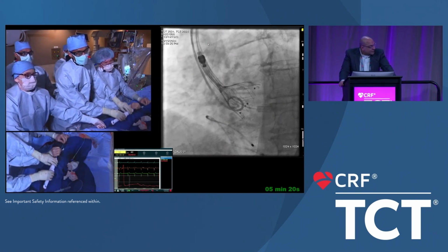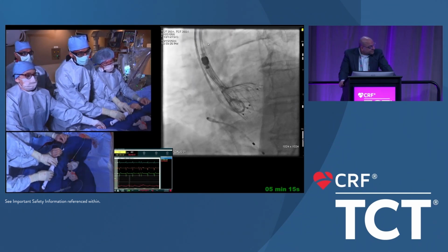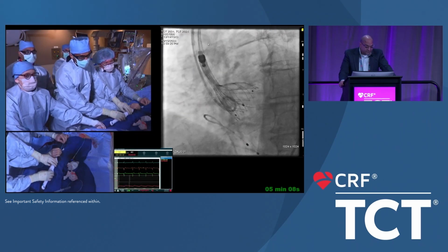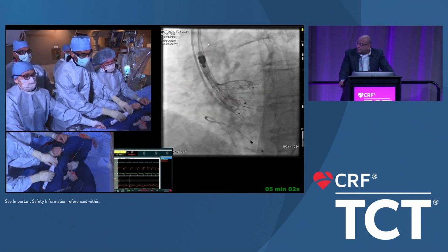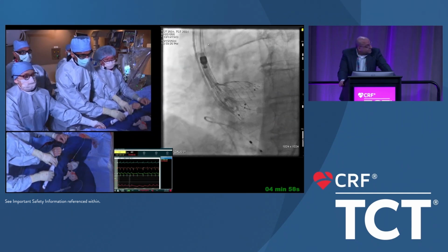That's the beauty of, I don't know who said it earlier, but you've got an opportunity with this valve to get it perfect, or as close to perfect as you think. Could you have released this? Probably. But honestly, I think I would do the same. Try to correct the coaxiality a little bit. Yeah, I agree on that.